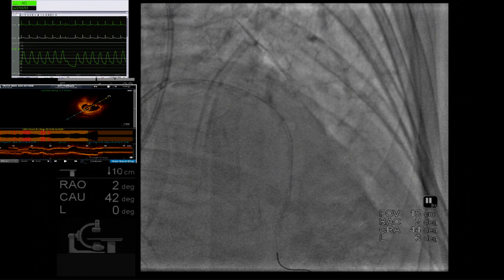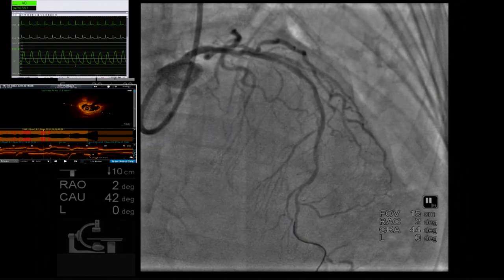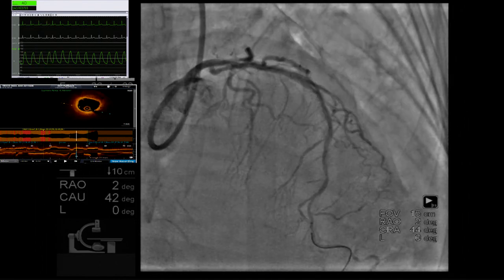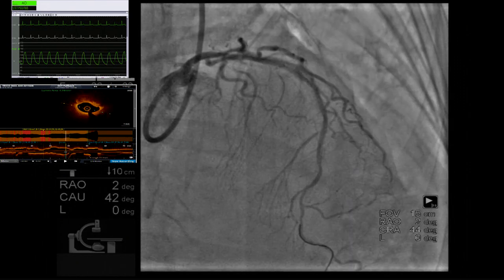So these are the things, you know, the property of the balloon of the stent is so important. If I was using, you know, Alpine or Expedition, I won't mind taking 2.5, but here I'll take 2.25. And that also will give negative residual. We'll see. We'll take 2.25.